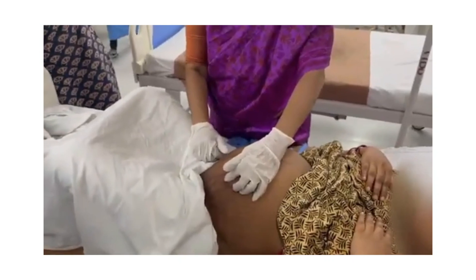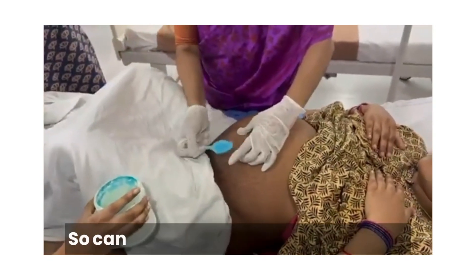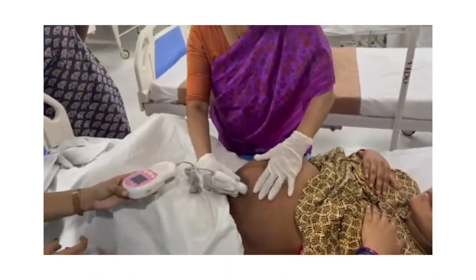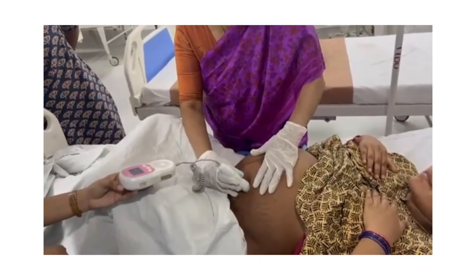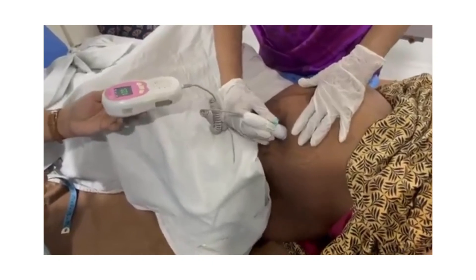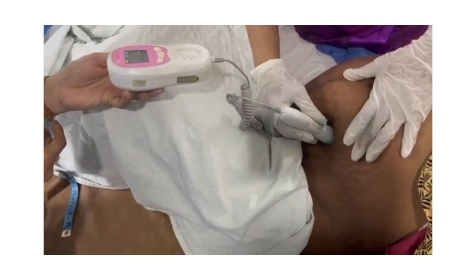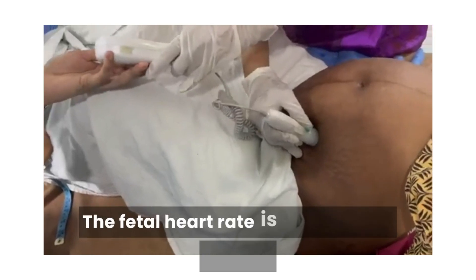I could also appreciate one fetal movement — that's a good sign. Can I have some gel? So can you put the fetal Doppler here? The fetal heart is 132 beats per minute.